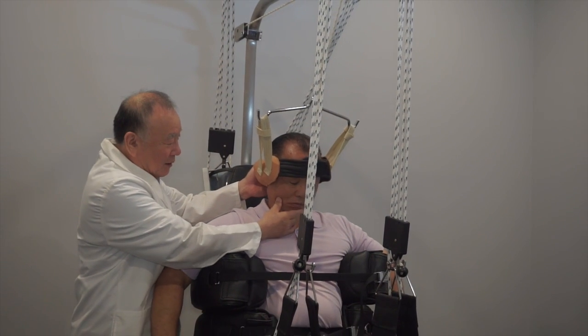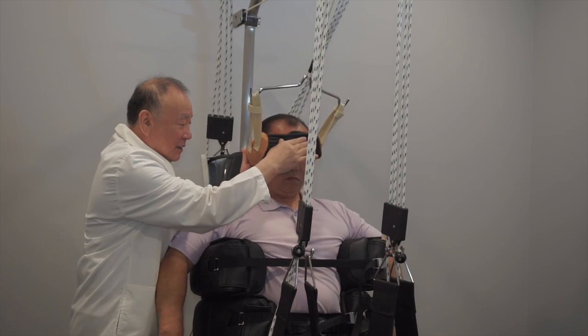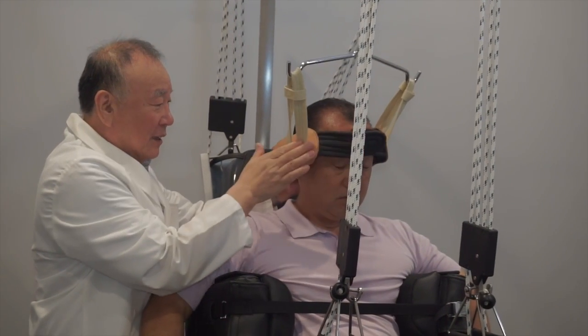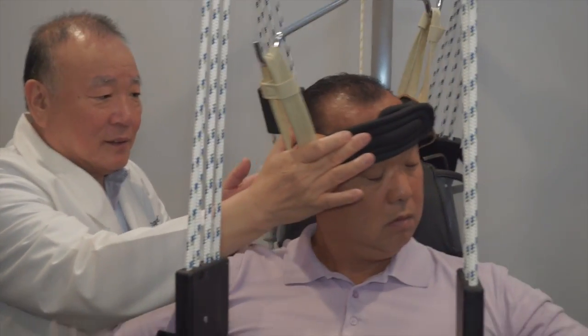Provide the movement and therapy as appropriate. Patient should push the head against the provider's hand. Push the head back and forth.